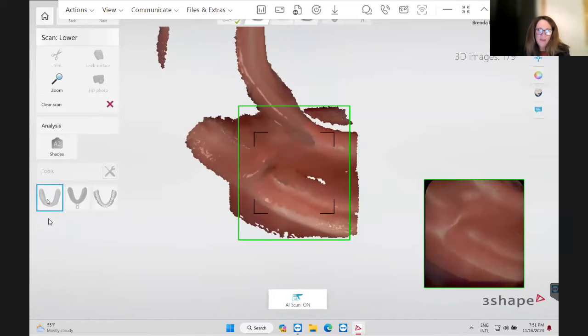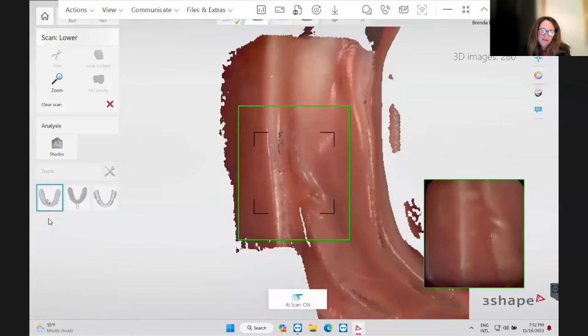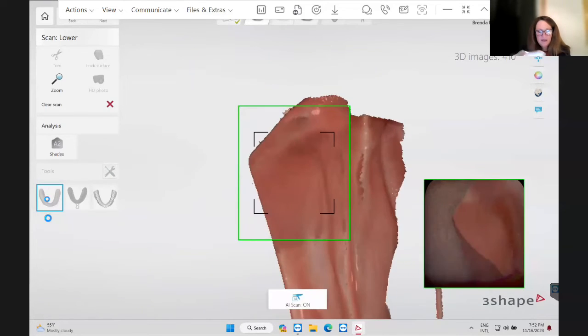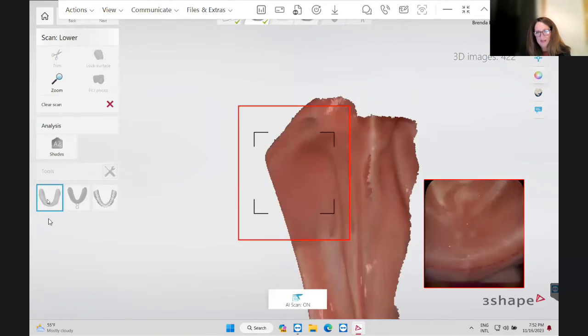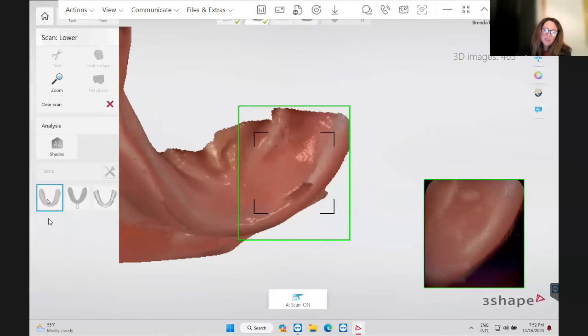Going to come to the midline, go back. But everybody's jealous right now because wouldn't it be so easy to do it like this in an office? True. And now I'm going to come back and come to the midline, and how about to the occlusal lingual.